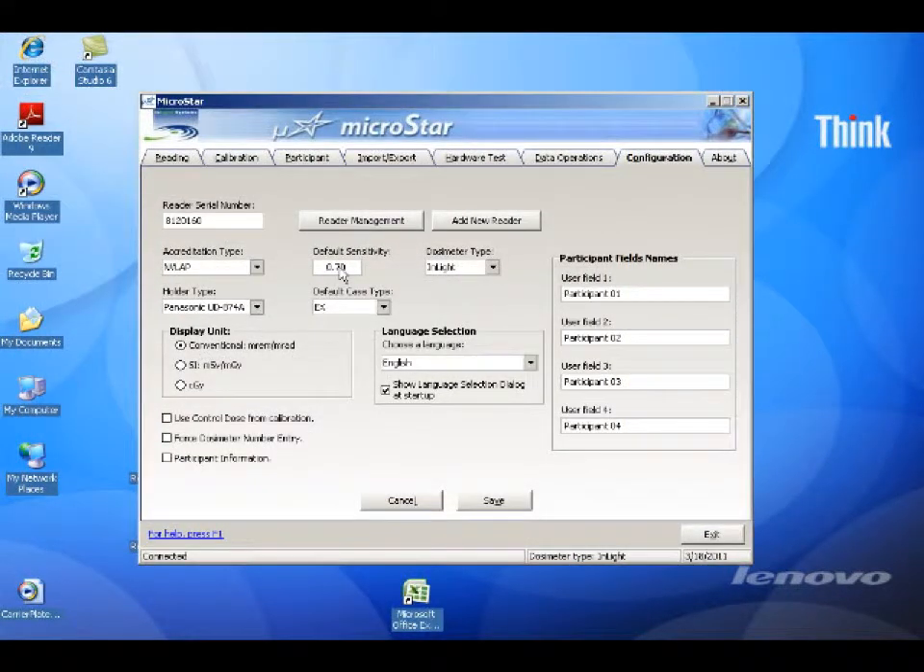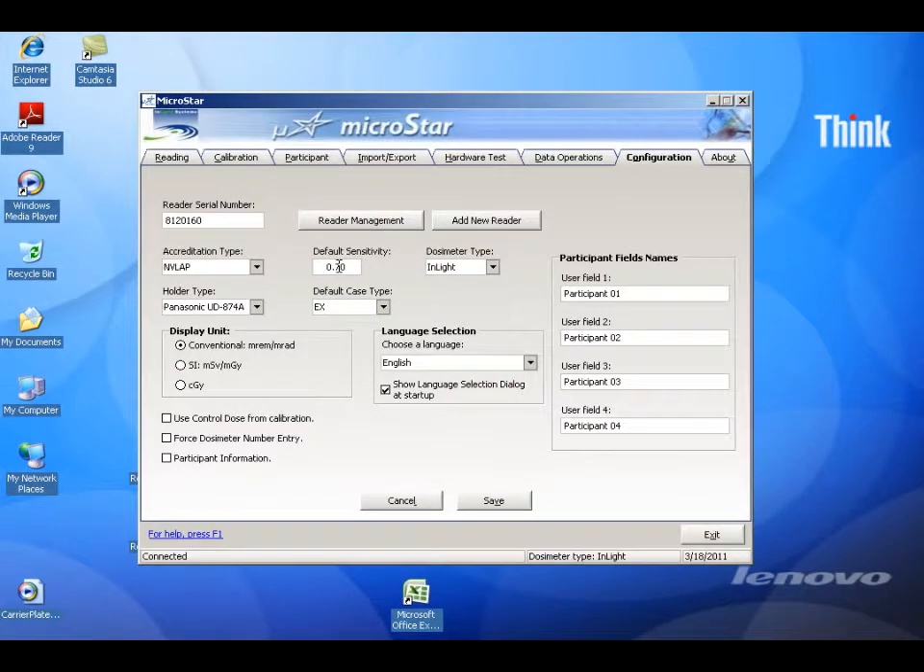You may be brought directly to the configuration screen. If not, click the Configuration tab. Set the default sensitivity to 0.9. Select the default case type to match the dosimeters that you will be reading. Select InLight as the dosimeter type. Select the holder type of the badges that you will be reading. Click the Save button, then click the Reading tab.